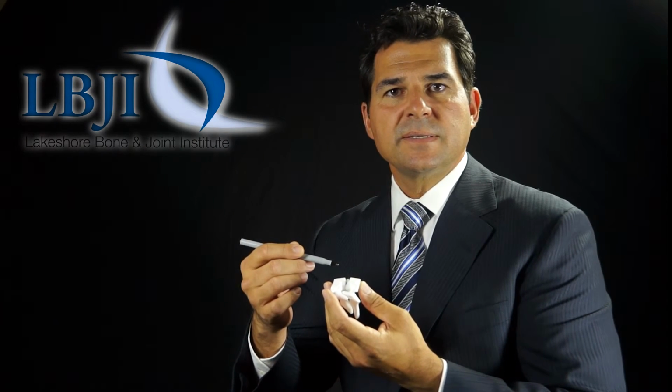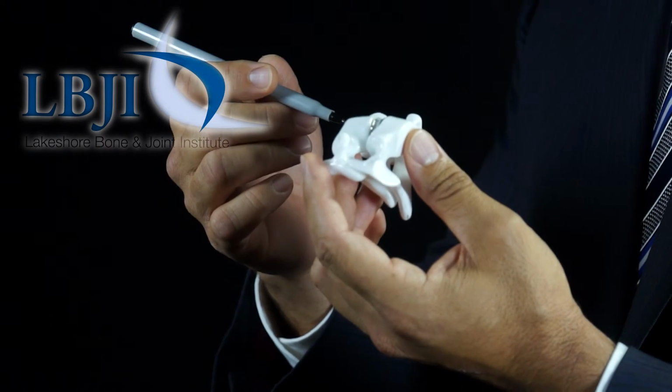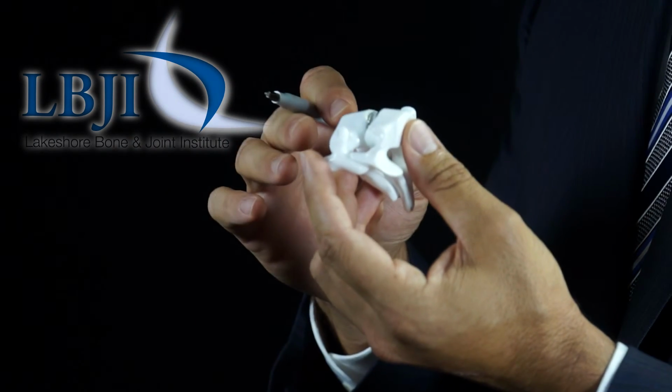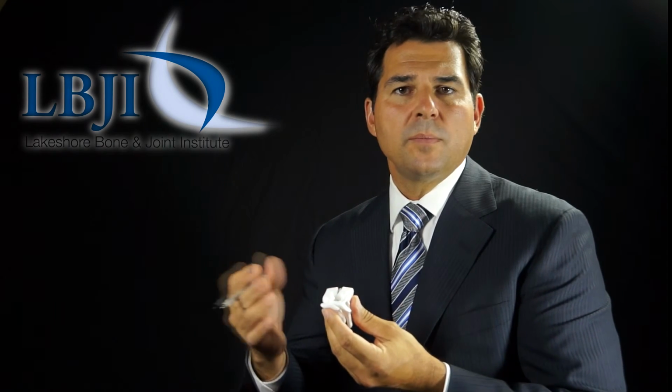Once the artificial disc is implanted, we obtain final X-rays in the operating room to make sure the implant is in good position and location. The alignment of the spine is anatomic. They're then transferred to the recovery room for post-operative recovery, and they're able to go home later that day.